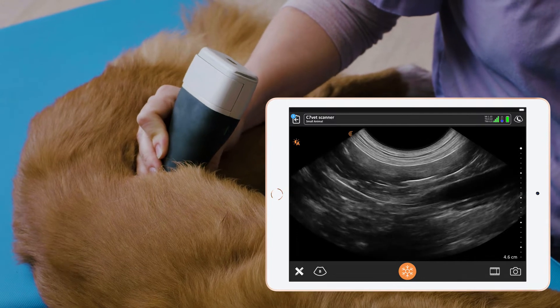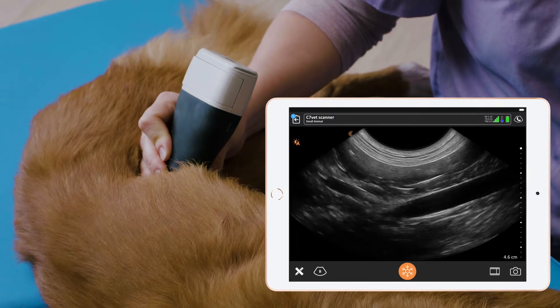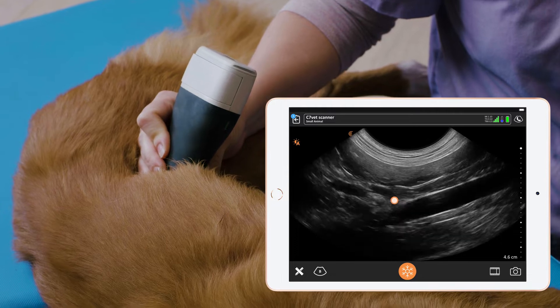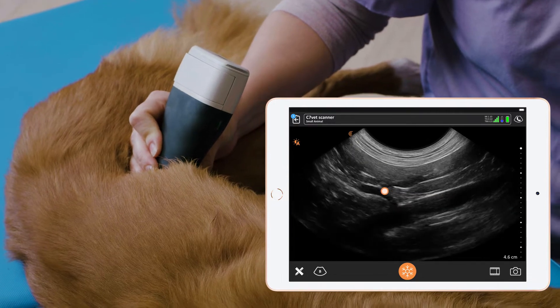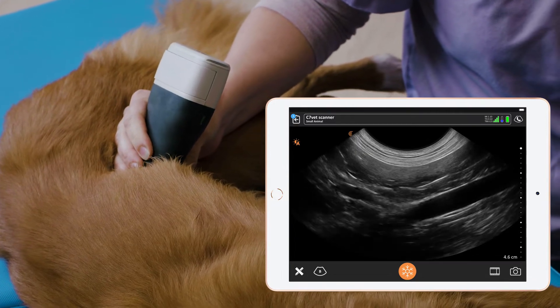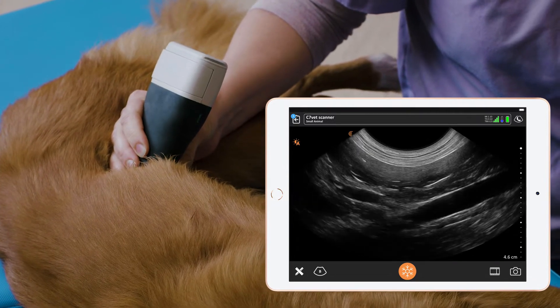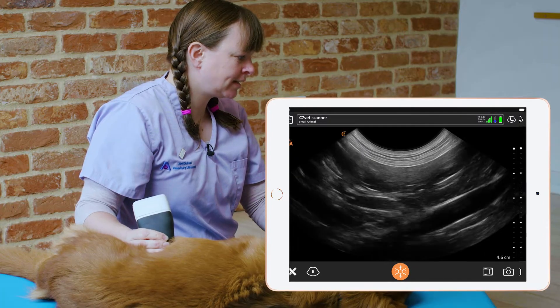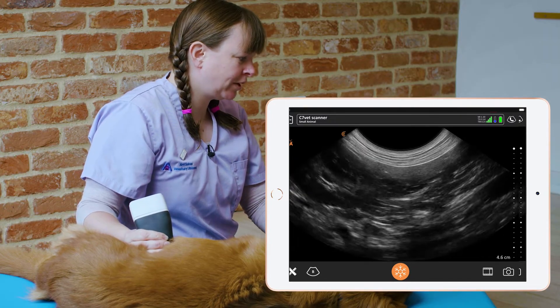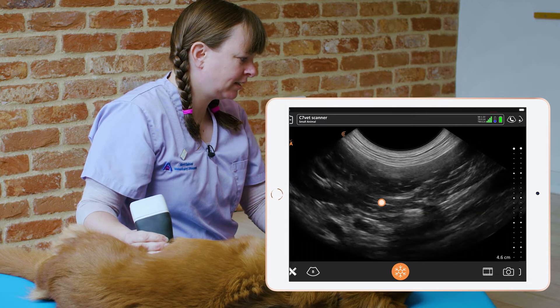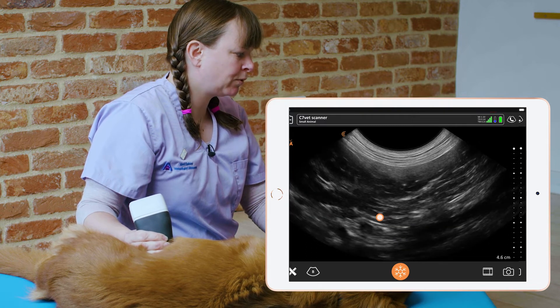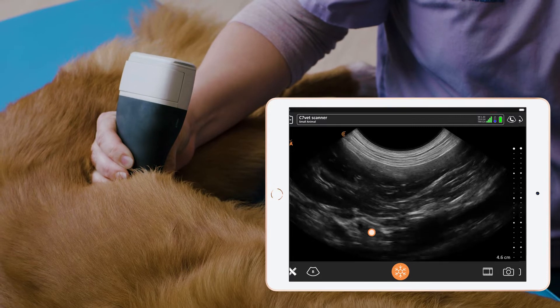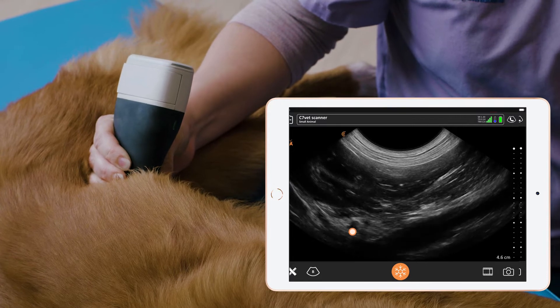We follow that forwards cranially and we see this curved artery leaving the aorta, and that is the renal artery. Just cranial to that will be the left adrenal gland, and just cranial to that we'll find the cranial mesenteric artery and the celiac artery.